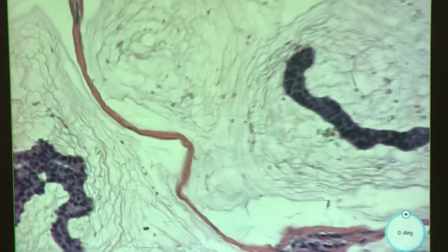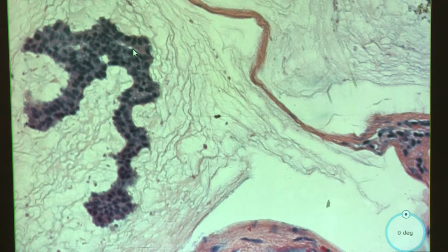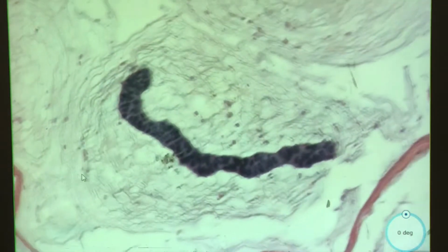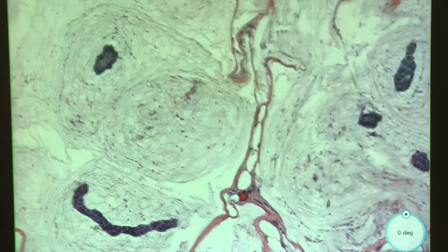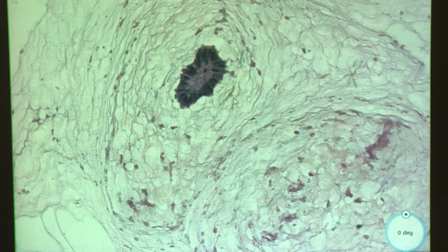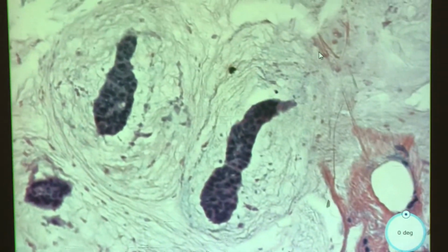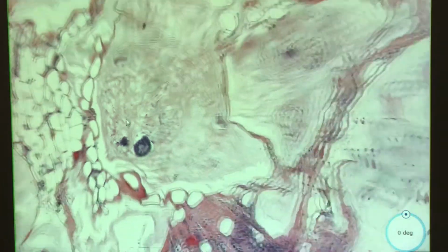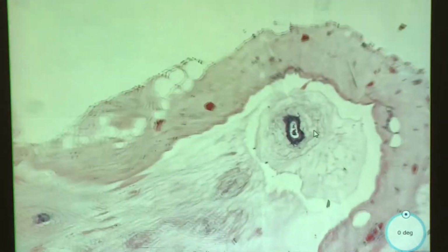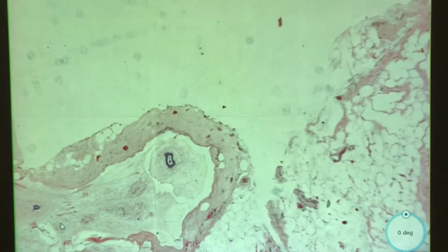Don't worry about it. Okay, so what I'm seeing with this is we have these clusters of not wildly atypical, but atypical cells. Oh, look, that one kind of looks like a little capillary extension that are swimming in these pools of mucin. And the atypical cells are only in the mucin pools. They're not really attached on their own, which probably means that they've kind of fallen off into this.